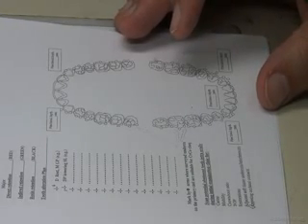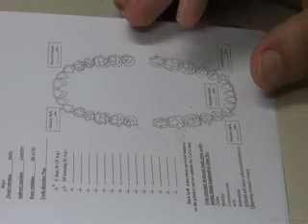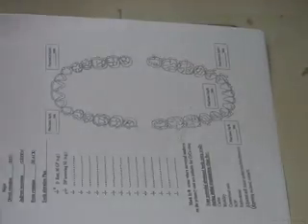So the empty form that we're going to fill in always is accompanied by the first page that we said it's the sequence of surveying on this side. It's the sequence of surveying of casts on this side. And then the steps for chrome-cobalt design, and this is included in this slide, okay? And this is to remind you of each component, not to forget it while you are doing your design. And it also gives you some indication on how to review any design, okay?